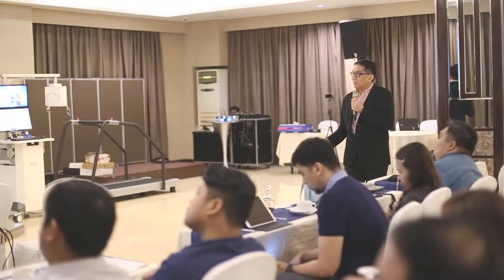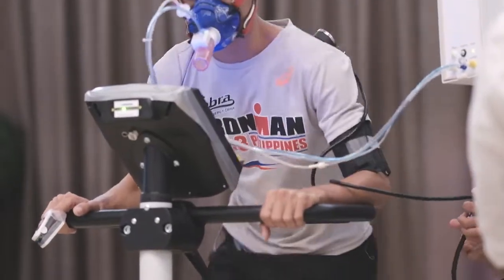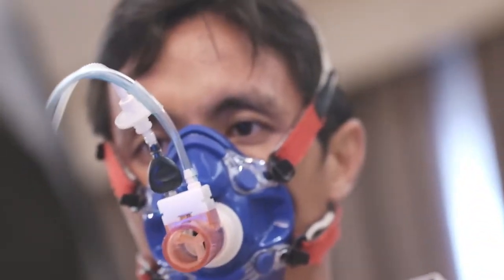The big blue one is the forced vital capacity flow volume loop. Okay, the small blue one is the resting tidal loop. And the red one is the exercise tidal loop of the patient during exercise. Let us now discuss the genesis of the exercise tidal loop. Okay, how the flow volume loop is generated.